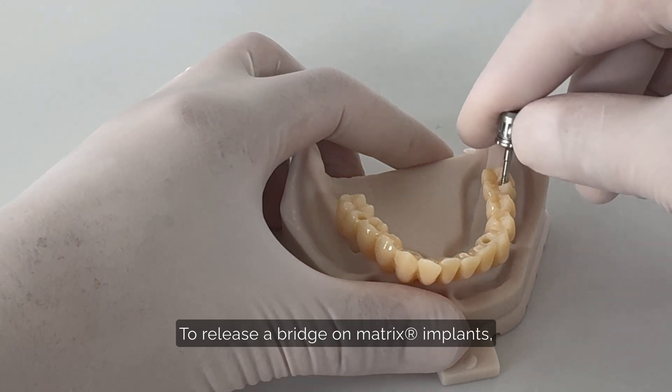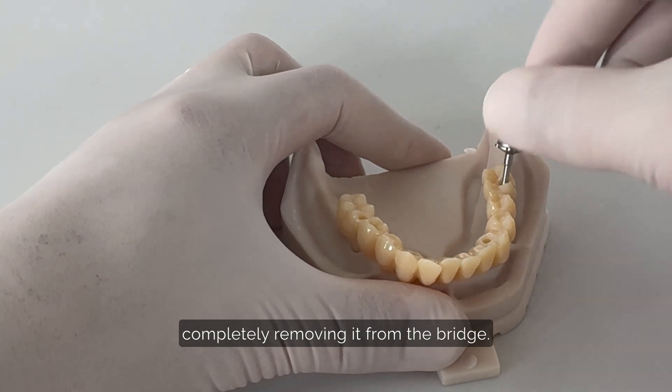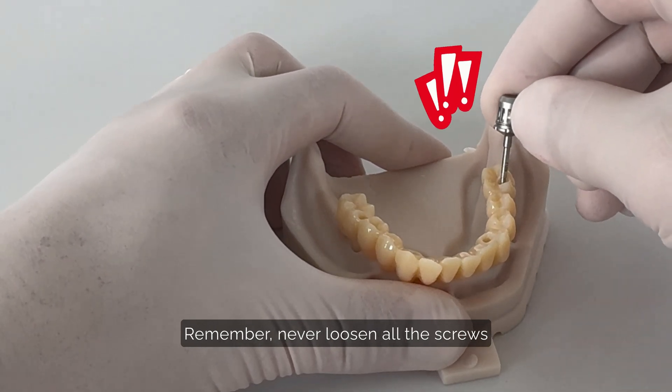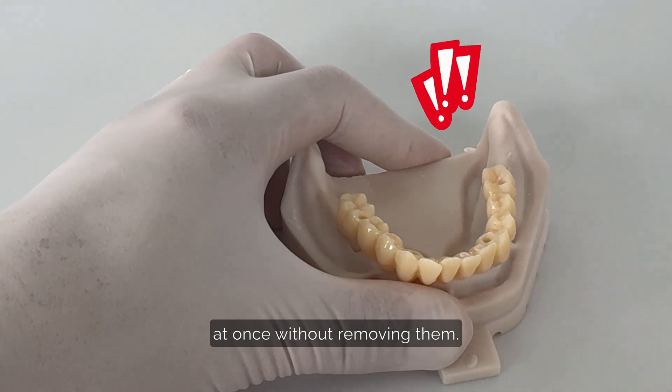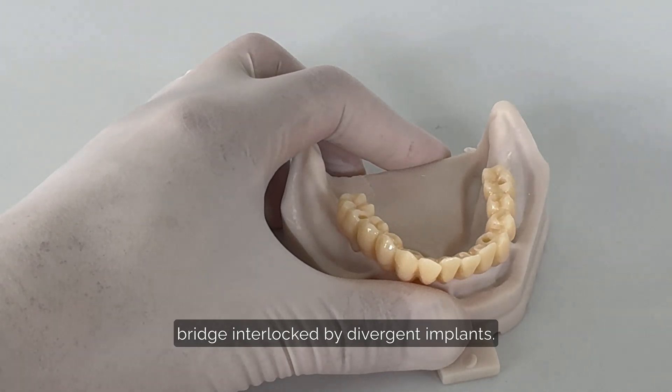To release a bridge on matrix implants, start by unscrewing the first screw and completely removing it from the bridge. Remember, never loosen all the screws at once without removing them. This will lead to a bridge interlocked by divergent implants.